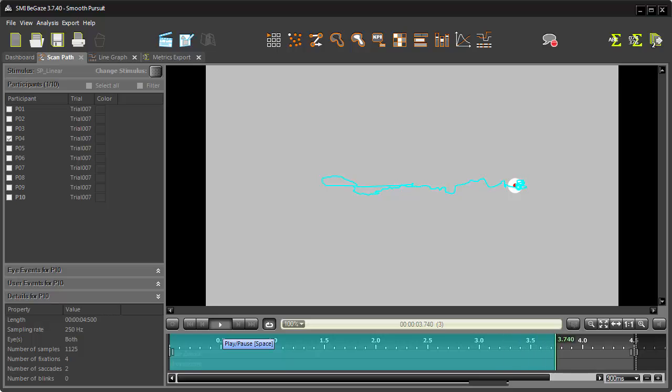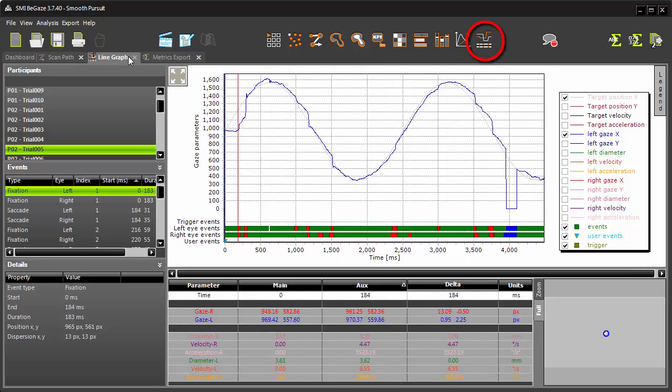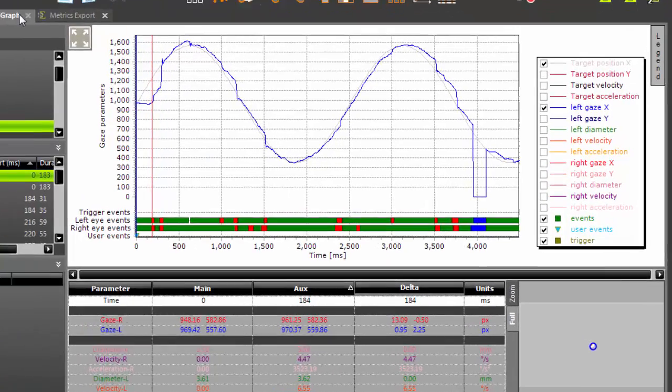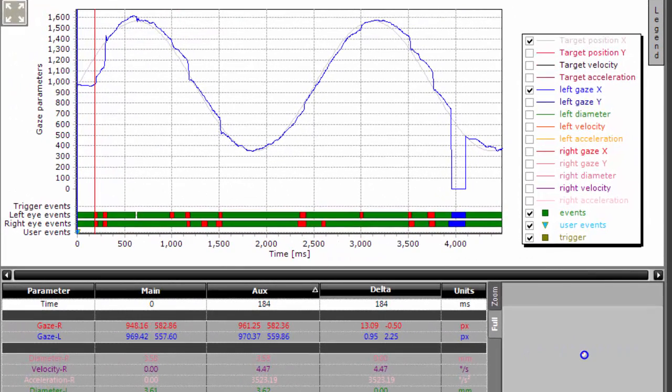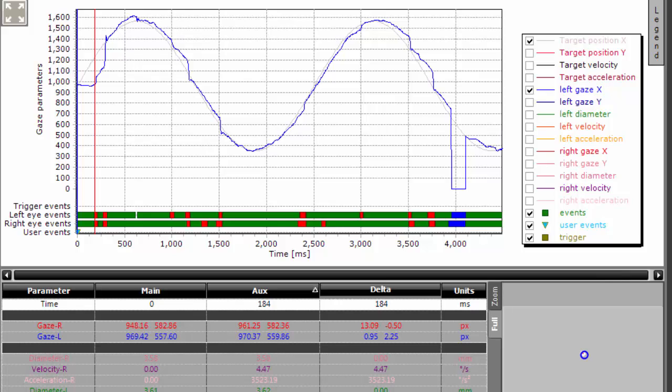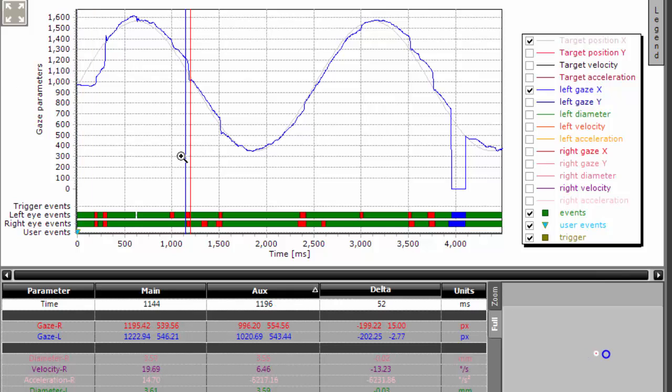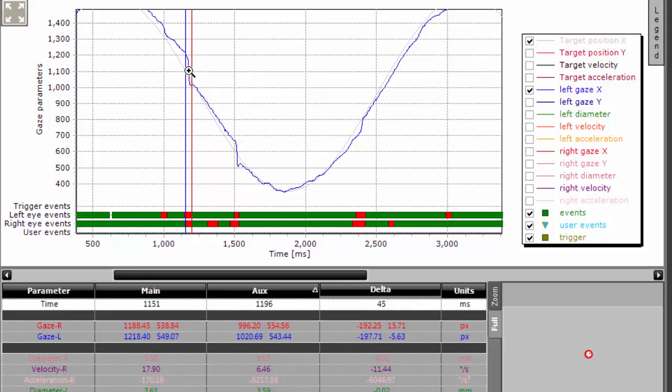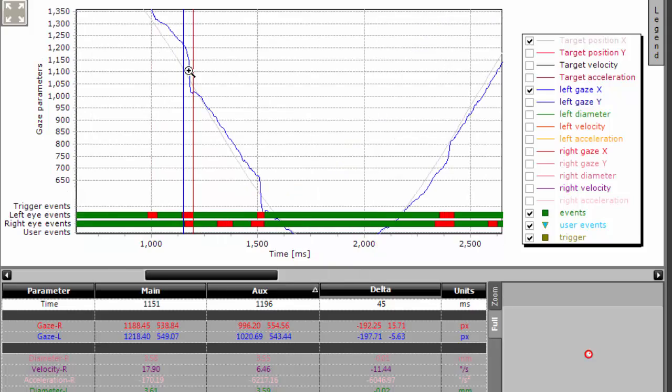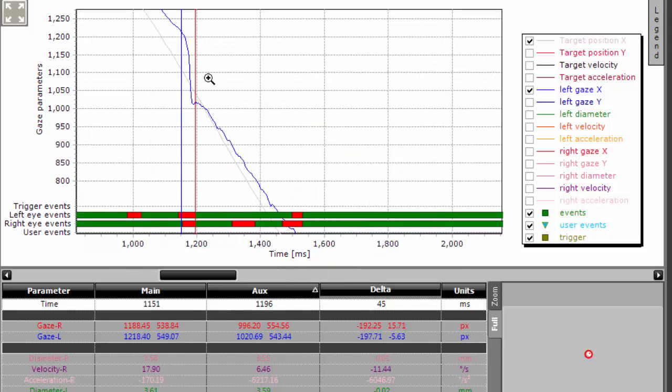Line graph is another pertinent visualization, where we can see a wide range of gaze data over time for one or more participants. There is also information regarding the target, like velocity and acceleration, all selectable on the right. The light gray target is clearly moving in a sinusoidal pattern, and we can see the participant's eye movement with respect to the target in dark blue. Select events such as this one to highlight saccades, in this example a catch-up saccade.